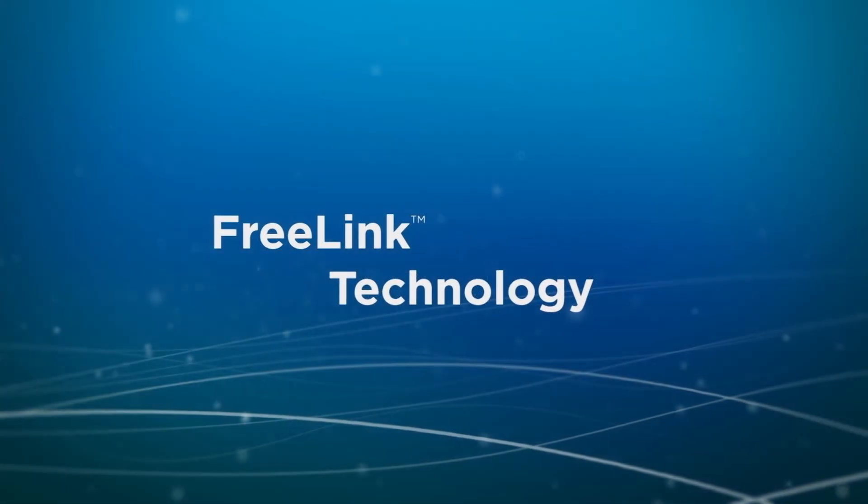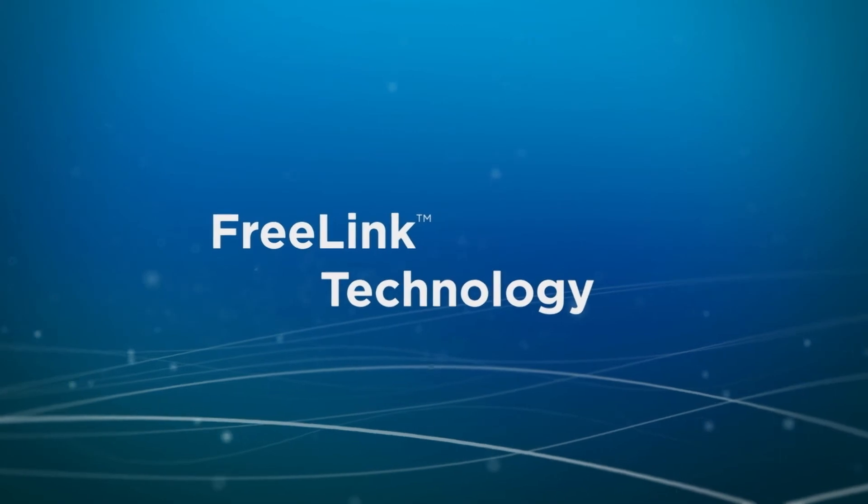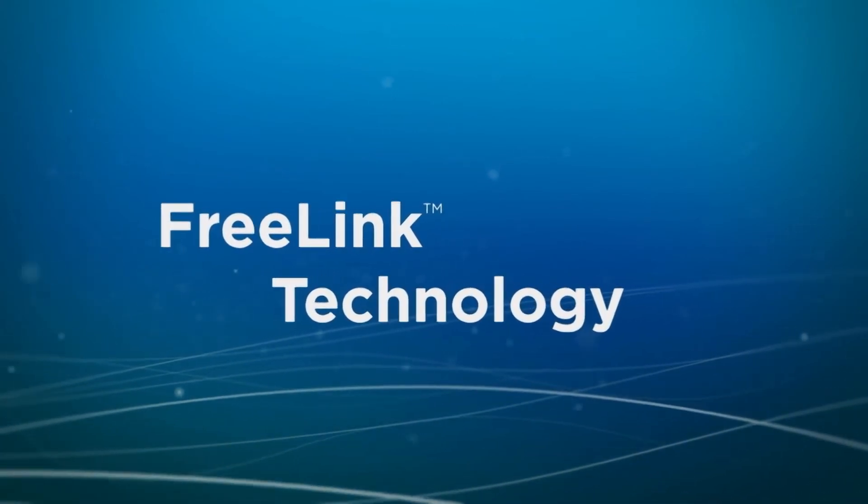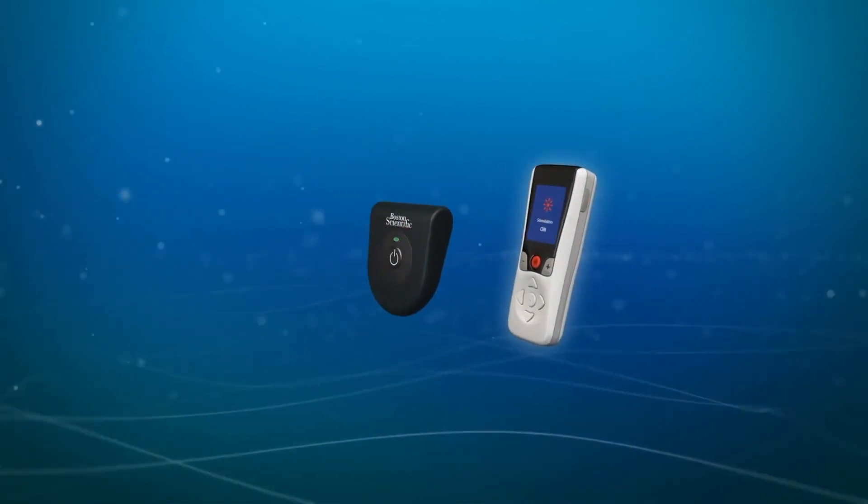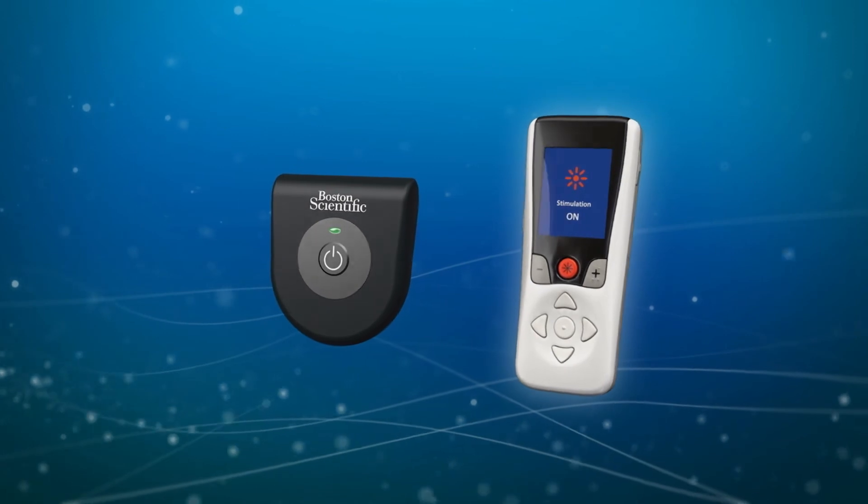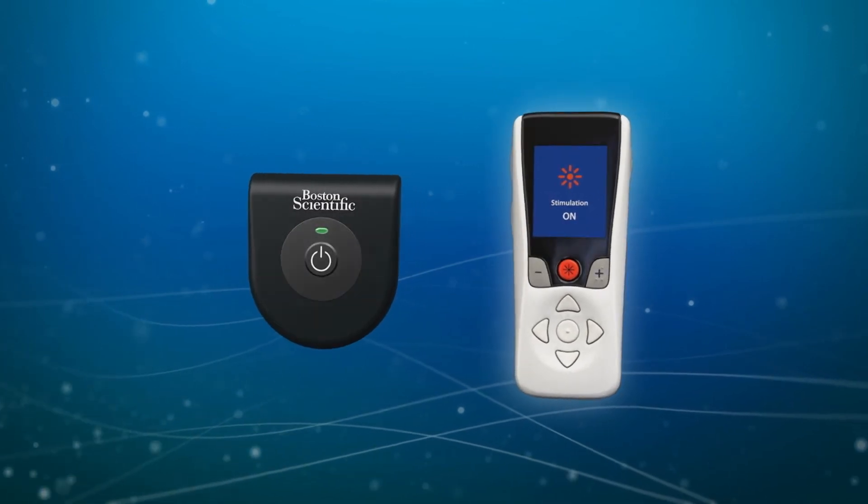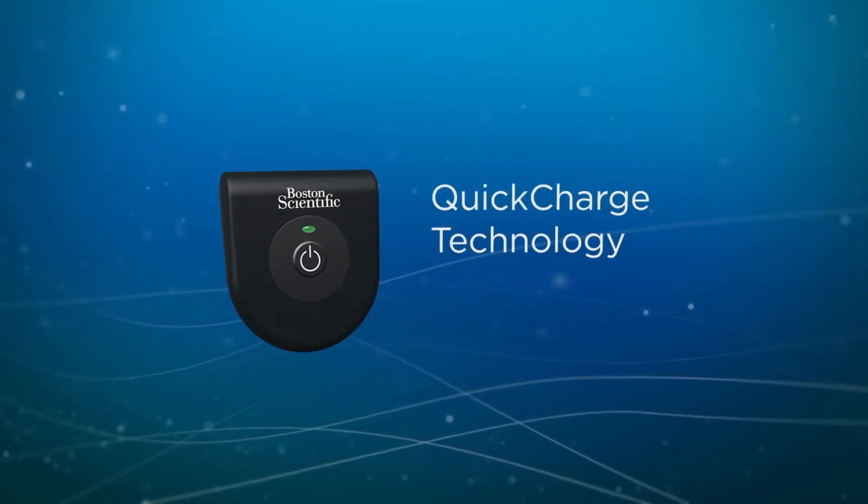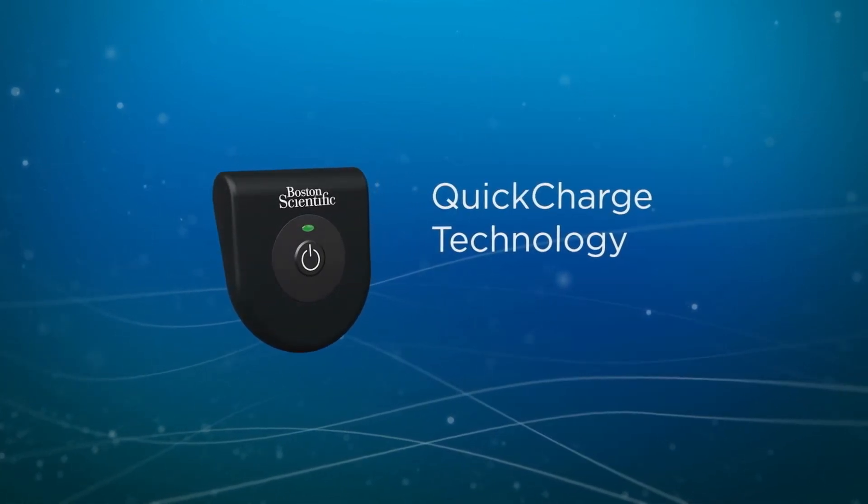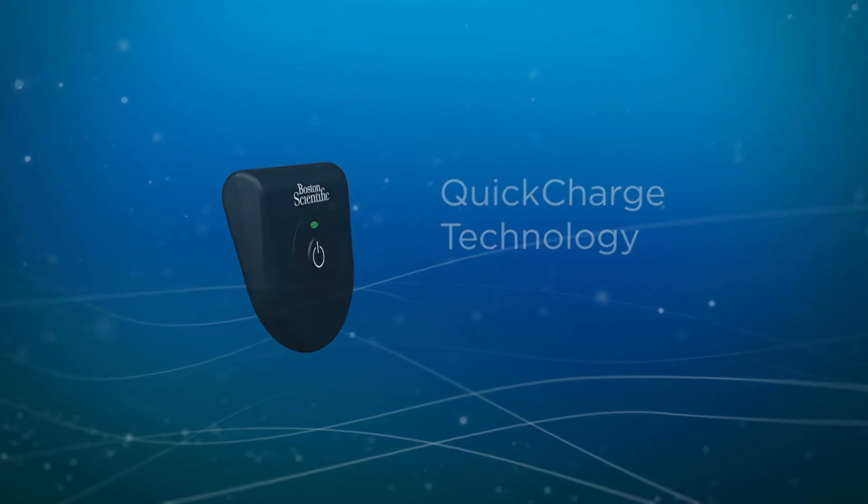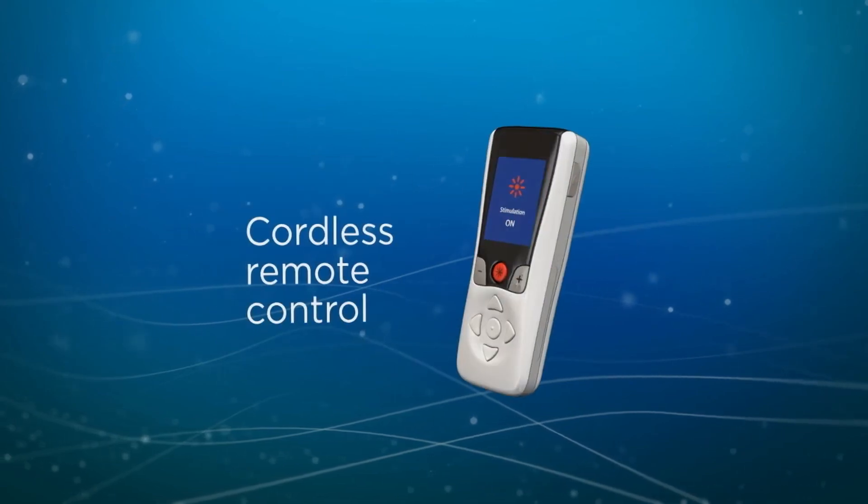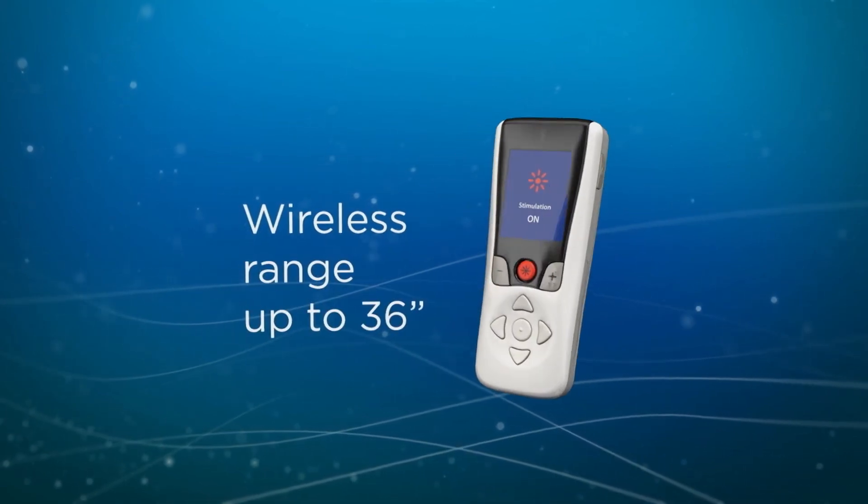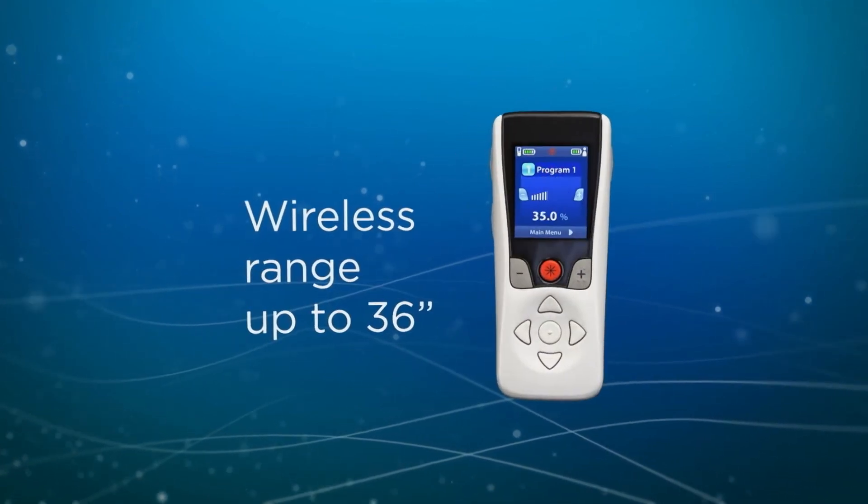Precision Spectra also features free link cordless technology offering enhanced cordless accessories designed to simplify the patient experience. Like providing a charger designed for efficient charging and a simple and intuitive new remote control with a wireless range of up to 36 inches.